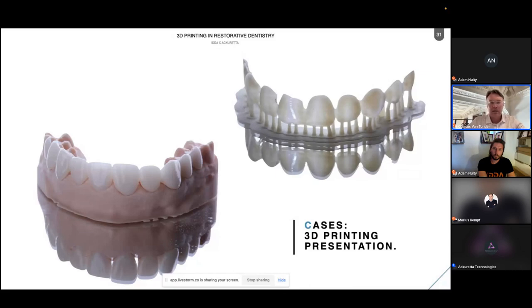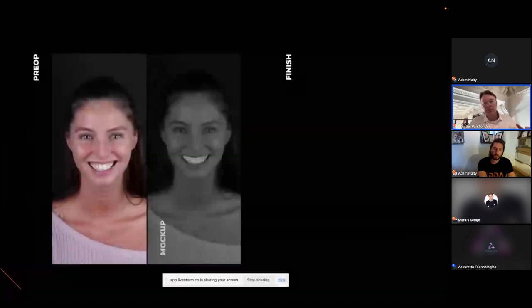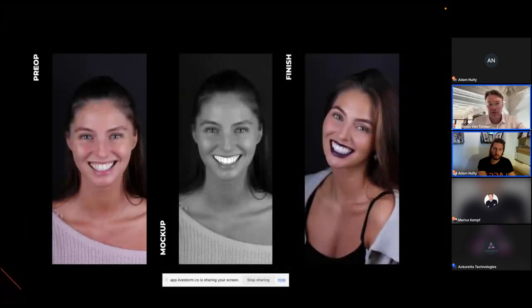I've got a case coming up in a few weeks' time where we are actually going to 3D print multiple mock-ups for the patient so that she can decide what she wants and how she wants the teeth to look, try them in for her, and then afterwards make ceramics of the final ones that she chooses. If you do that with indirect mock-ups, you can, but it is a lot more hassle and a lot more messy. So it's become a lot cleaner in the workflows.